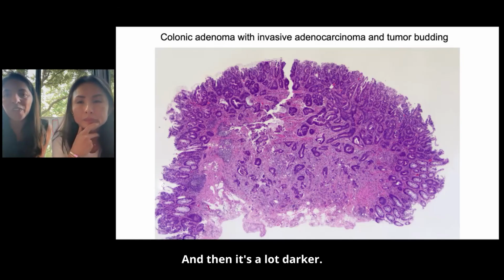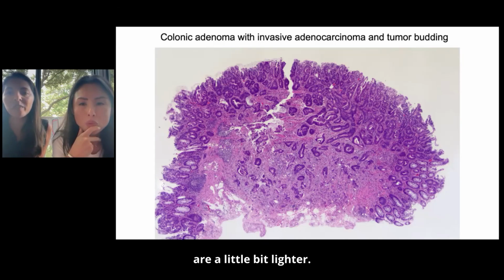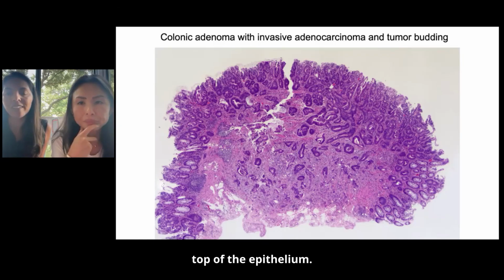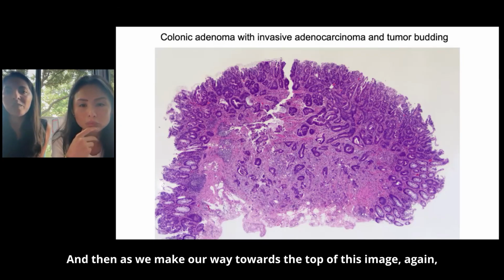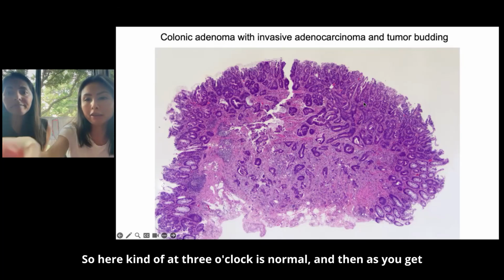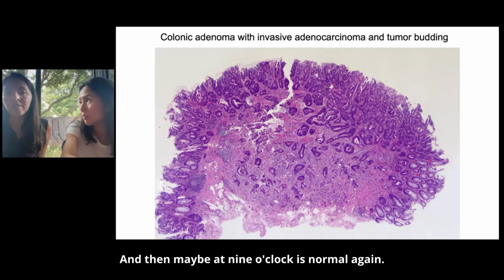And then it's a lot darker. So if we're looking again at the bottom of that image, you can kind of see how the cells are a little bit lighter. You can still see kind of that mucin making those little purple circles kind of at the top of the epithelium. And then as we make our way towards the top of this image, again, everything is starting to look dark and disorganized. So here, kind of at 3 o'clock is normal, and then as you get backwards to like 1 o'clock, 1 o'clock to 10 o'clock is abnormal, and then maybe at 9 o'clock is normal again.